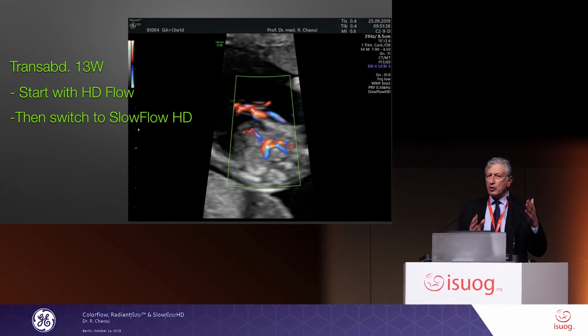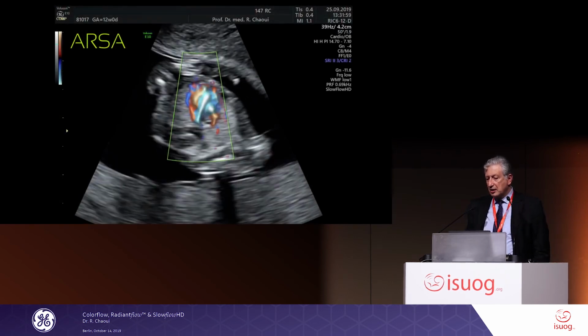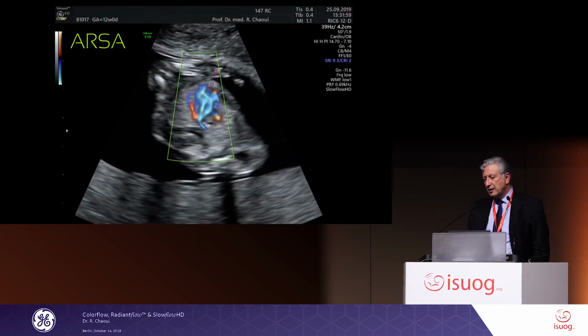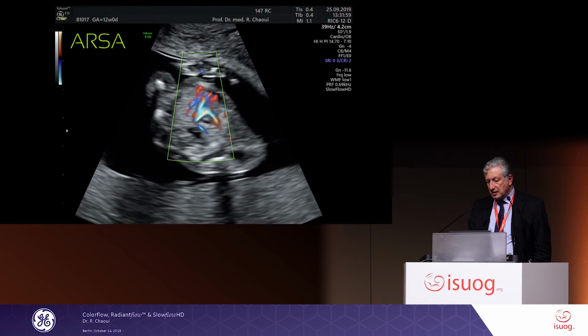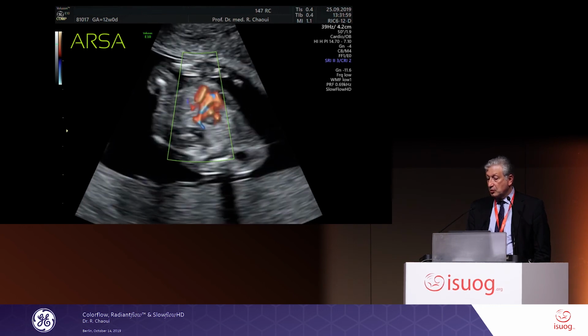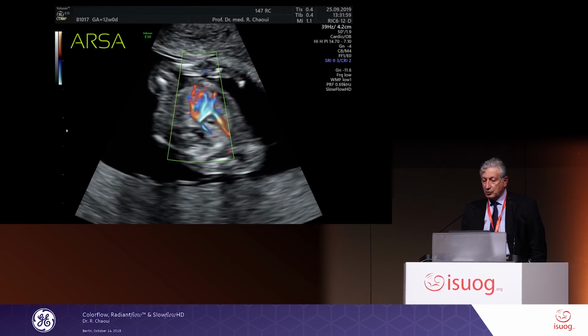Because what I'm doing now, I want to look at tiny vessels, and this is how I do it. The same, I can do it also for the pulmonary veins. But you see here, this is a fetus scanned transvaginally to demonstrate the aberrant subclavian artery, and you see how clearly you can see it. And if you have experience with color or HD flow, this is a view you will really love to have. But as you have seen here, I'll show it to you again, that the color for the heart is not very well demonstrable. So, by playing with the preset, I moved here from 0.4 to a higher mode.